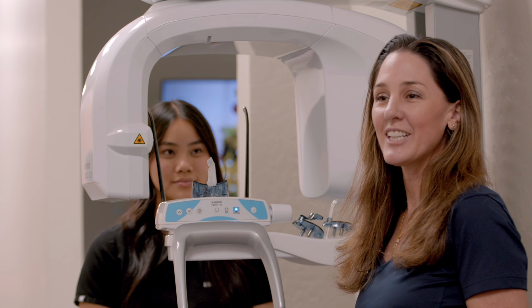Okay, so from there, we're gonna just make sure and kind of guide Vicki in. Go ahead and put your chin right there. And then can you feel that little notch, Vicki? Okay, perfect. So from here, we're gonna go ahead and turn on the laser light. Oops, first actually, we need to take a step forward. We're gonna go ahead and tell the machine earlier that we are ready to take that pano shot. And then it looks like it's accepted.